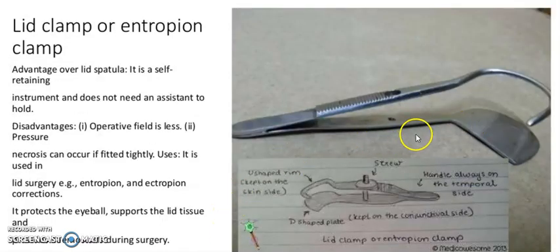It is a lid clamp or entropion clamp. The advantage over a lid speculum: it is a self-retaining instrument and does not need an assistant to hold. Disadvantages: the operative field is less, and pressure necrosis can occur if applied too tightly. Uses: it is used in lid surgery, entropion and ectropion correction. It protects the eyeball, supports the lid tissue, and provides hemostasis during surgery.